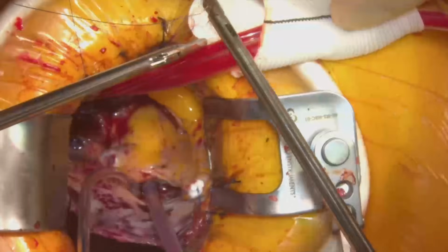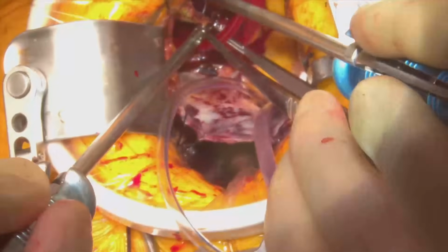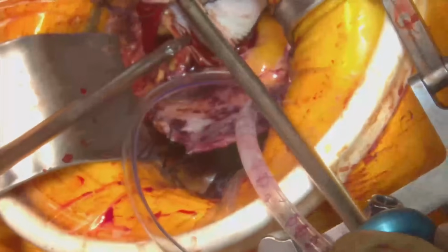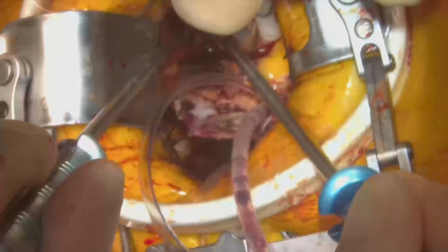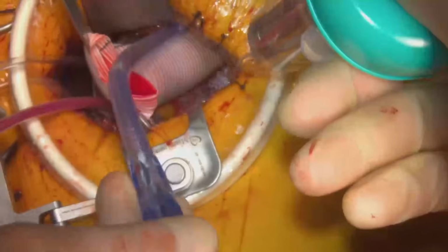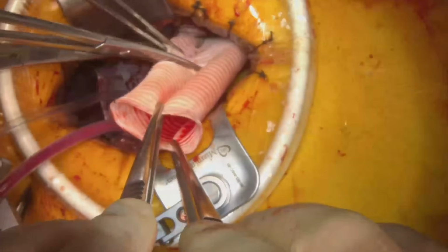A balloon-tipped catheter was inserted into the innominate artery under direct vision, and ACP was instituted. The distal anastomosis was performed in a running fashion using a 4-0 Prolene. Once the distal anastomosis was done, the pump was gradually restarted and hemostasis was checked. The graft was then transected to the appropriate length.